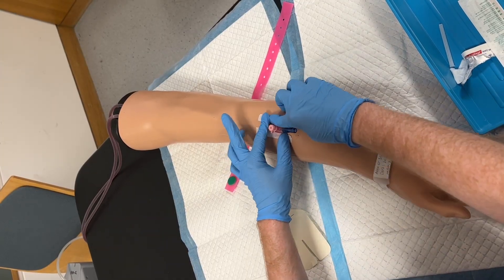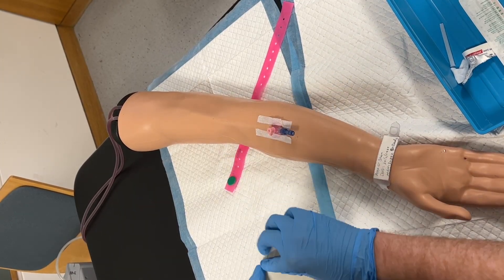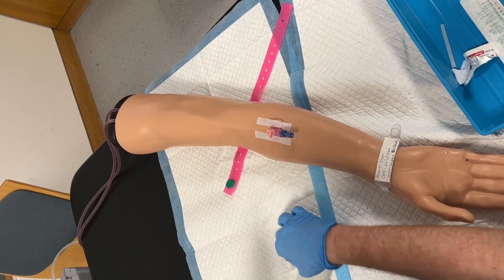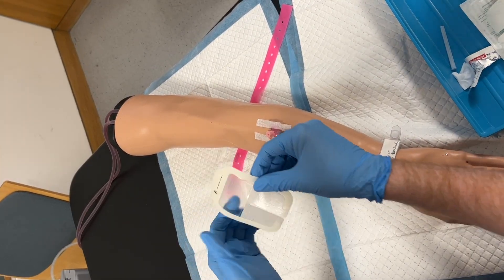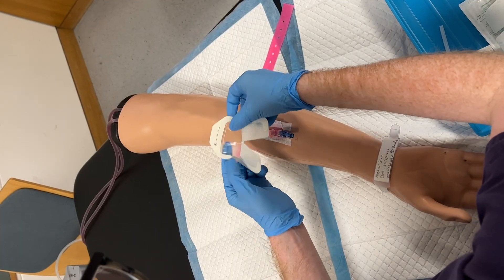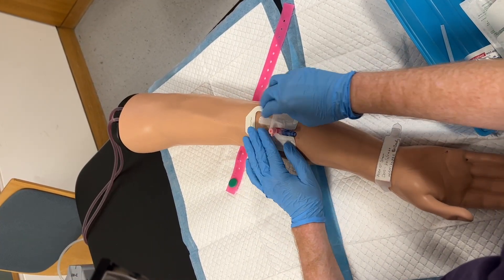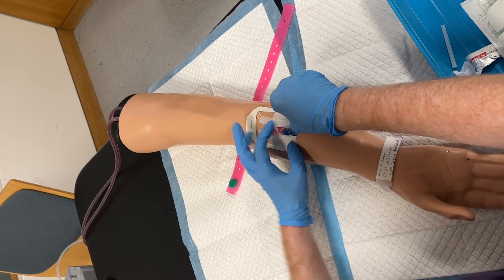There are many different varieties of IV dressing available in the clinical environment. In this case, strips are first placed on the wings of the cannula before a transparent dressing is placed over the top. It is important to familiarise yourself with the type of dressing in use in your institution, as well as how to put this on effectively.